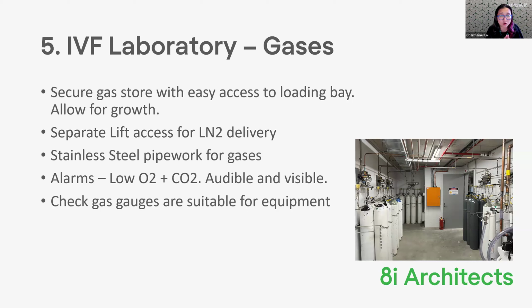Alarms. So make sure your gas rooms where you've got your LN2 store, and even your normal gas rooms, have alarms, both audible and visible, so that it's making a noise and a light, so that people on the outside of the room are aware before they walk into the room that there's been a gas leak. So a low CO2, a high CO2, and a low O2 monitor.